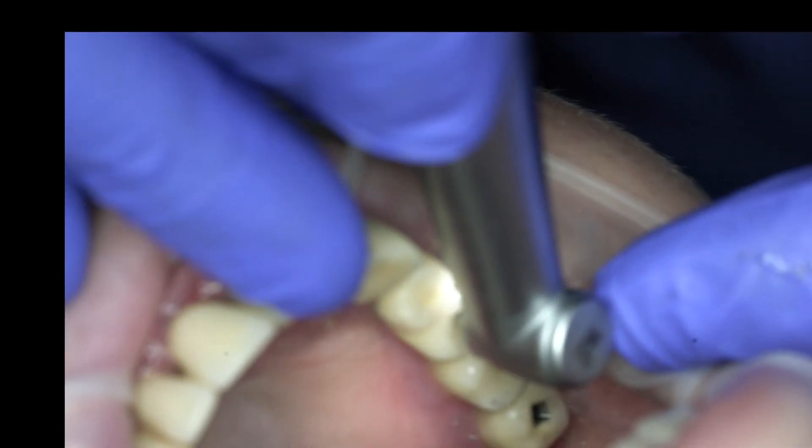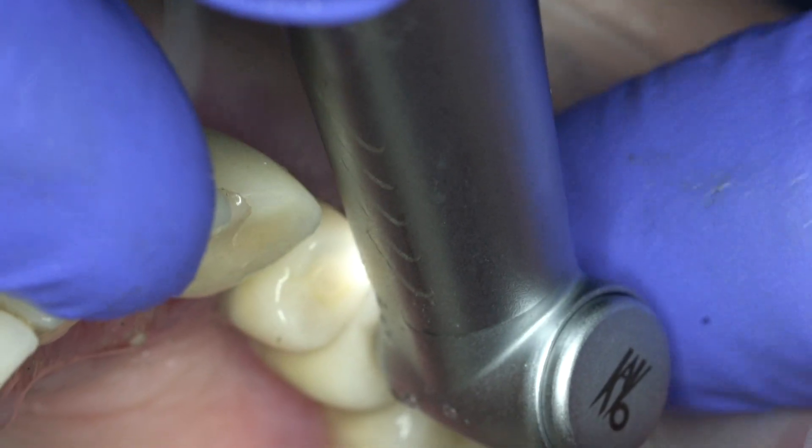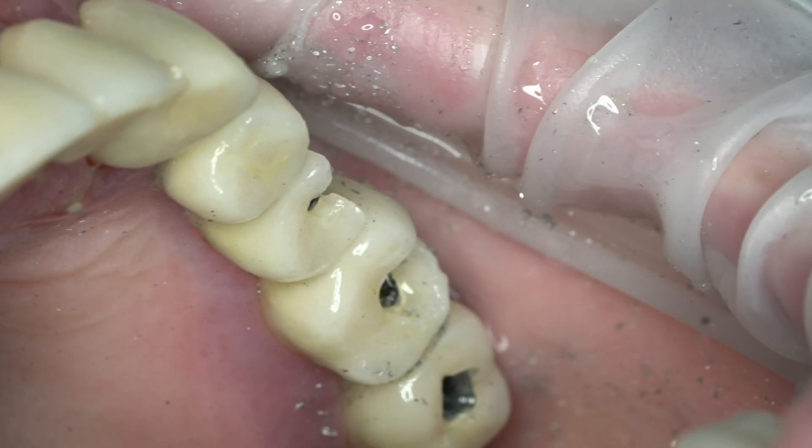In such a situation, it is necessary to divert the drilling to the vestibular surface and drill out an even larger volume of material, which often leads to significant chips of the ceramic.